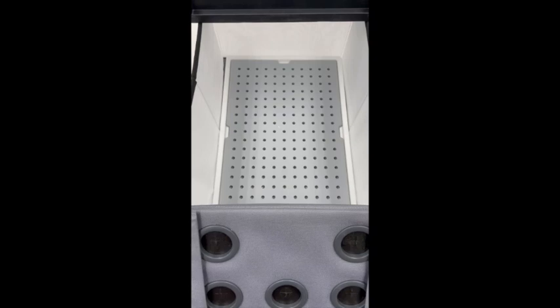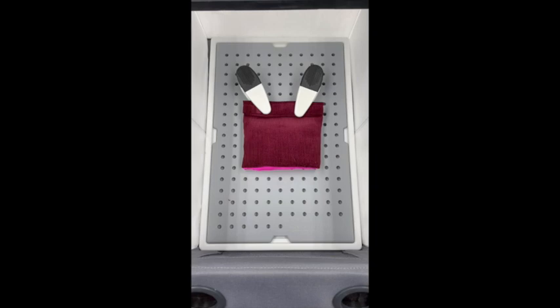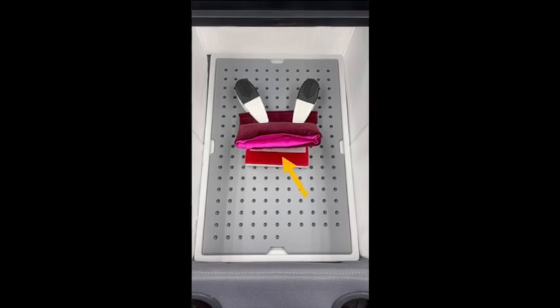To set up the vaginal cuff model, first arrange two clips towards the back of the box. Next, fold the bottom of the vaginal cuff model and clip onto the board. To elevate the vaginal cuff opening, place a supporting object underneath.